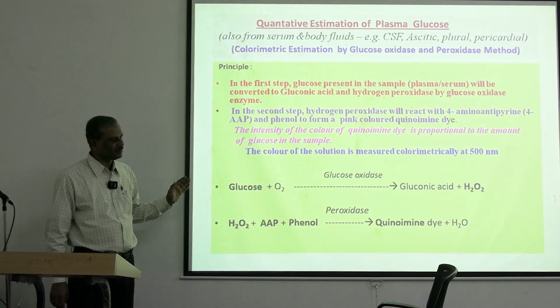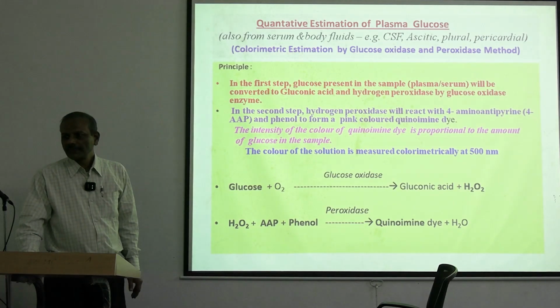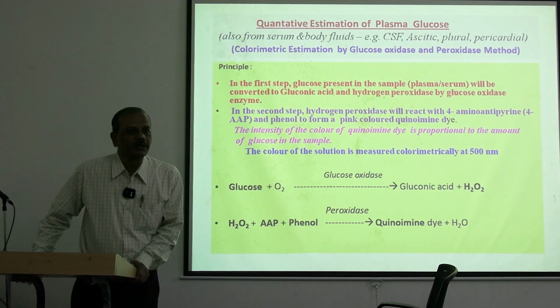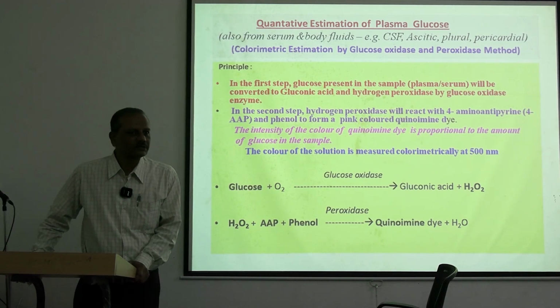Is this part clear? So this basically deals with Beer's law. Are you clear about Beer's law? Beer's law? Has it been told? No? Yes, somebody said yes.